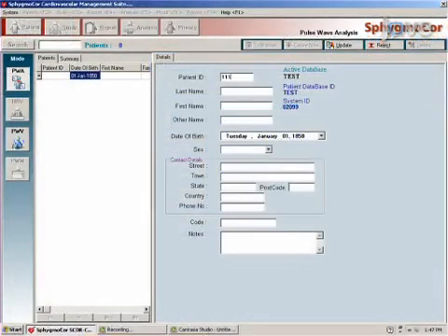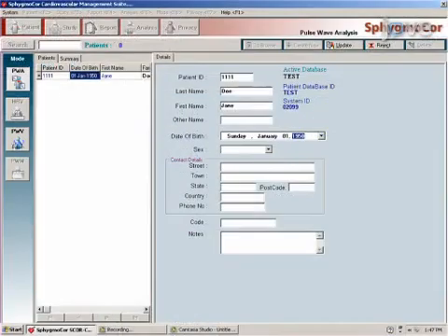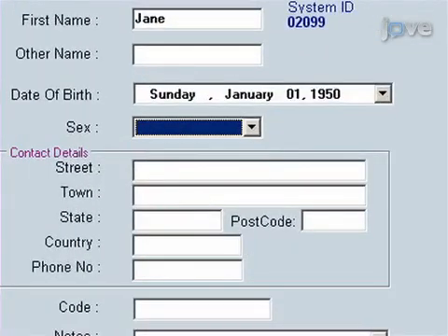Next, enter the patient details such as last name, first name, date of birth, and gender. Then click Save.